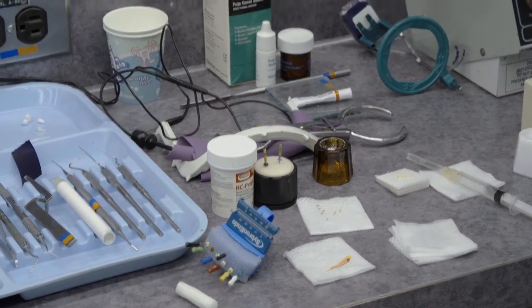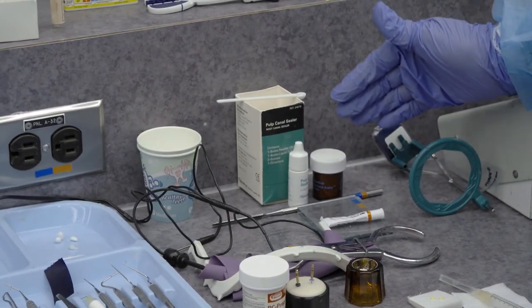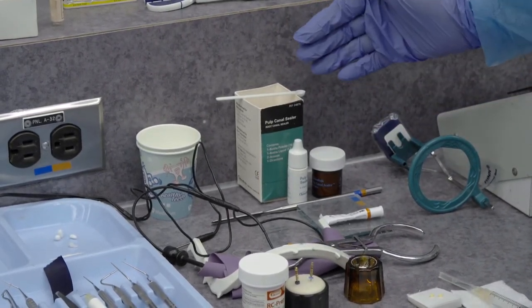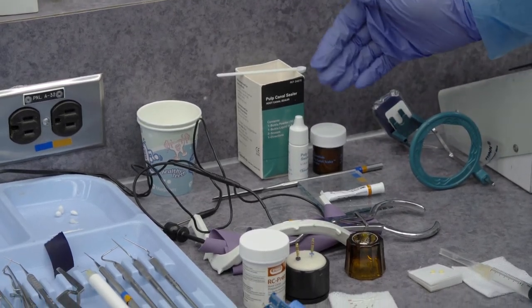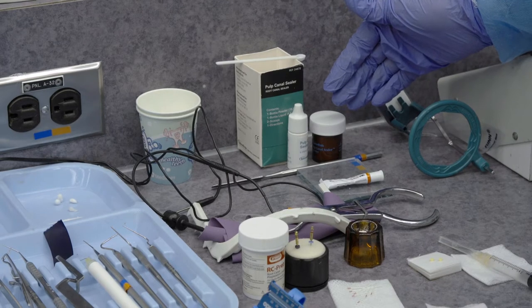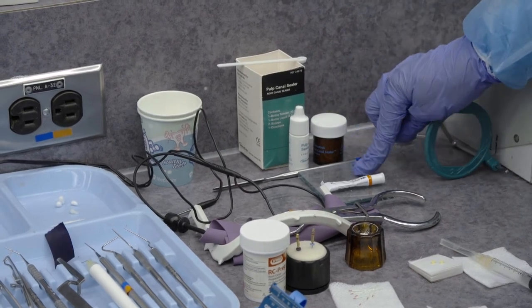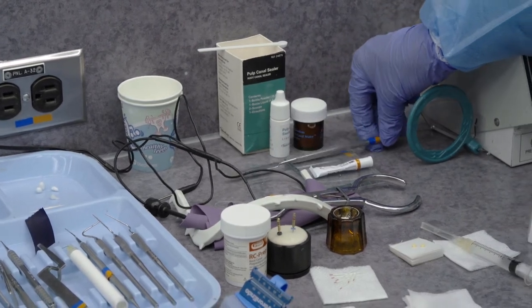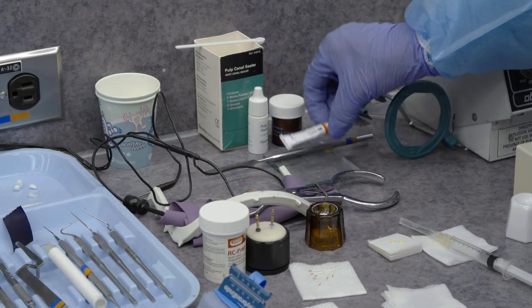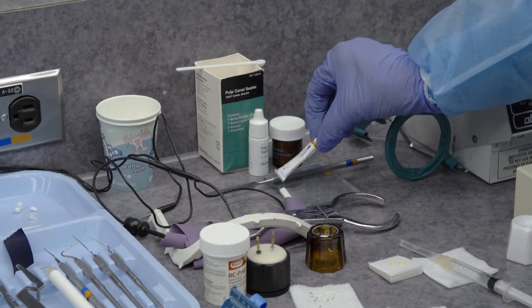We have here again our Cybron Endo sealer. Now, according to most procedures, there are many types of sealer, but this is one example of an endodontic sealer that's available on the market. I have here a glass slab for the sealer along with the spatula. I have the temporization filling, which is the Cavit.